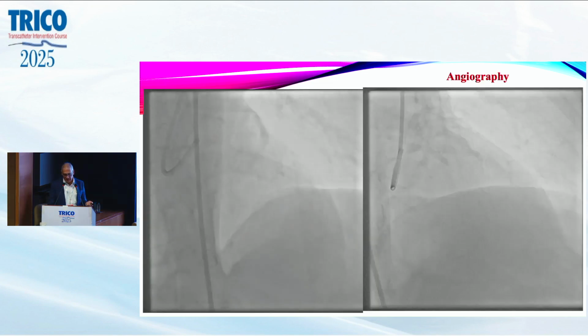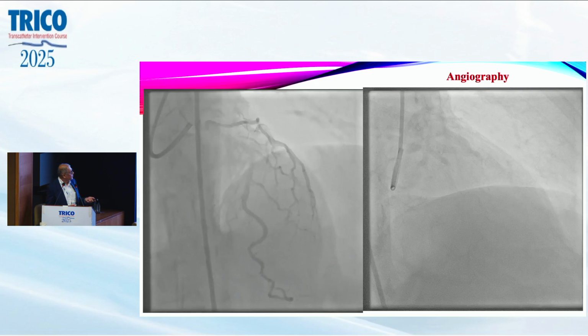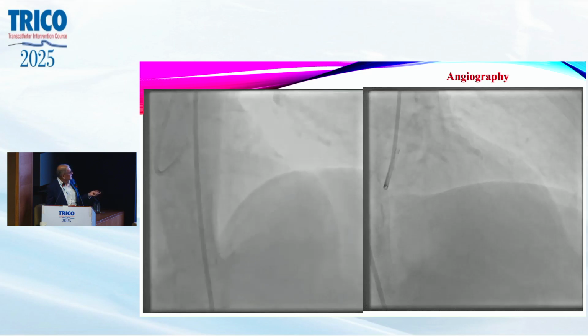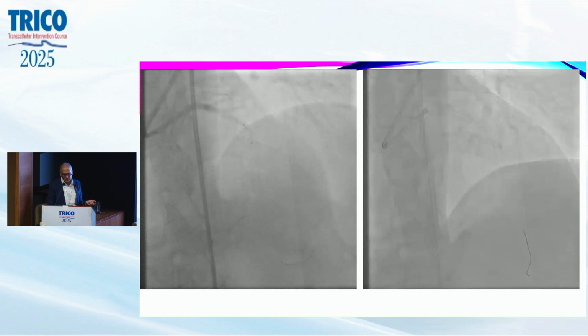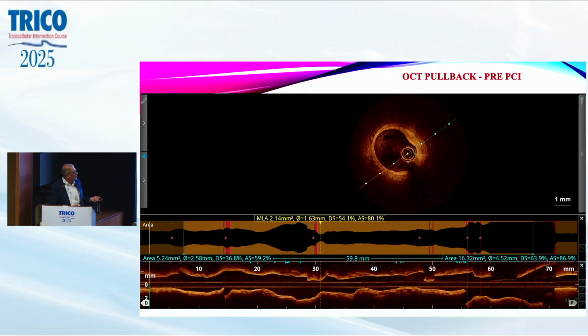This patient had an angioplasty before. In the mid-LAD you see there's a fairly reasonable lesion there. It looks fairly innocuous. I put in a balloon there, dilated it, it gave way a little bit, and this is the OCT. I'll let this play.